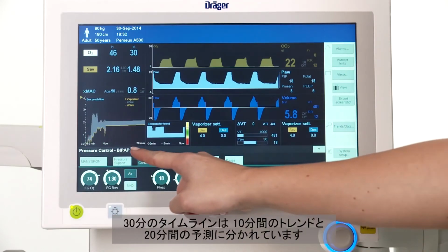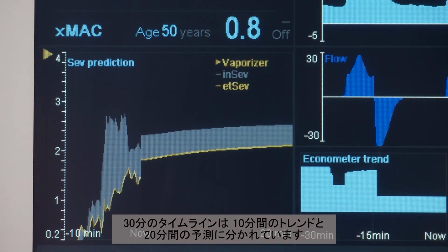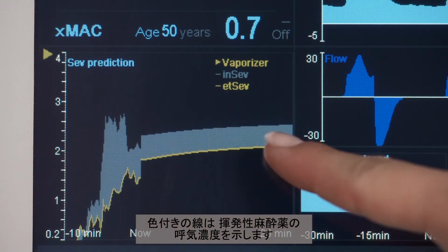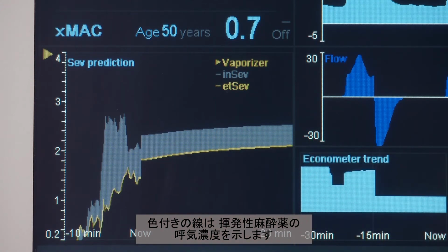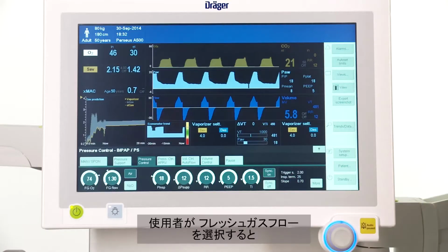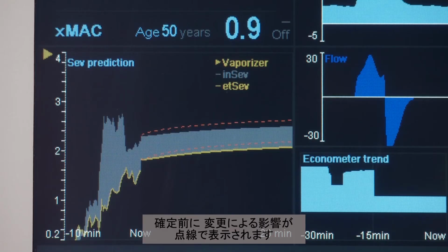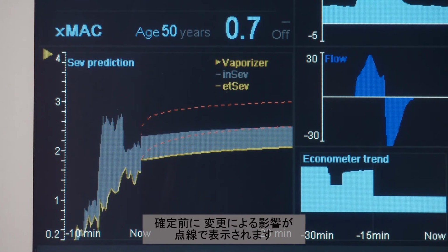The 30-minute timeline is divided into a 10-minute trend and a 20-minute forecast. The coloured line shows the end tidal concentration of the volatile anesthetic agent. The other edge of the grey area represents the inspiratory concentration. If the operator selects the fresh gas flow, a dotted line will show the possible impact of changed settings before they're confirmed.